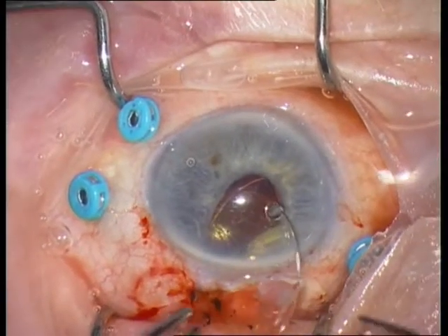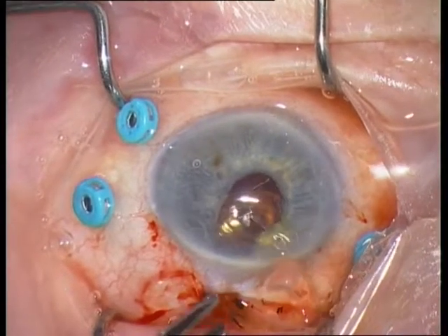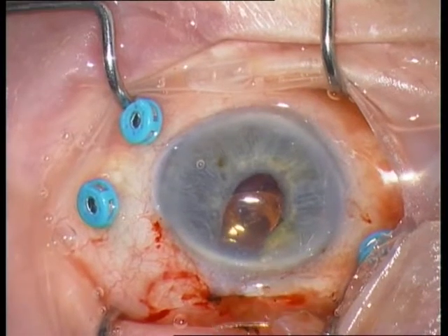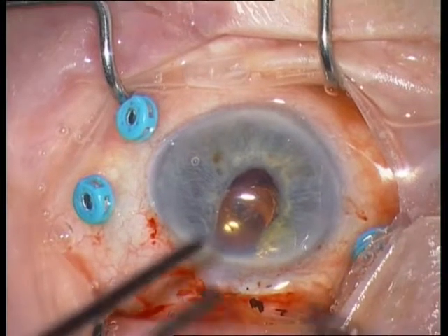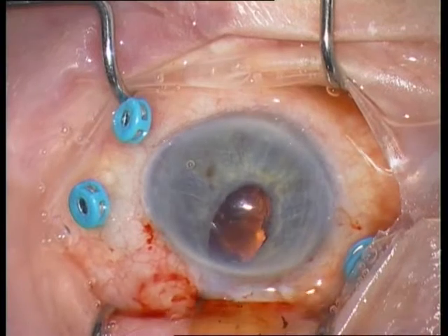I am removing now the capsular tension ring — I think it is a Cionni ring. And finally the IOL is removed.